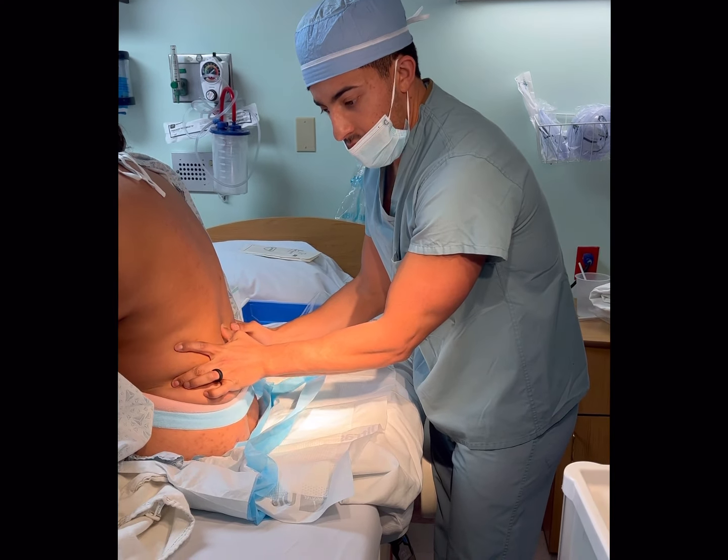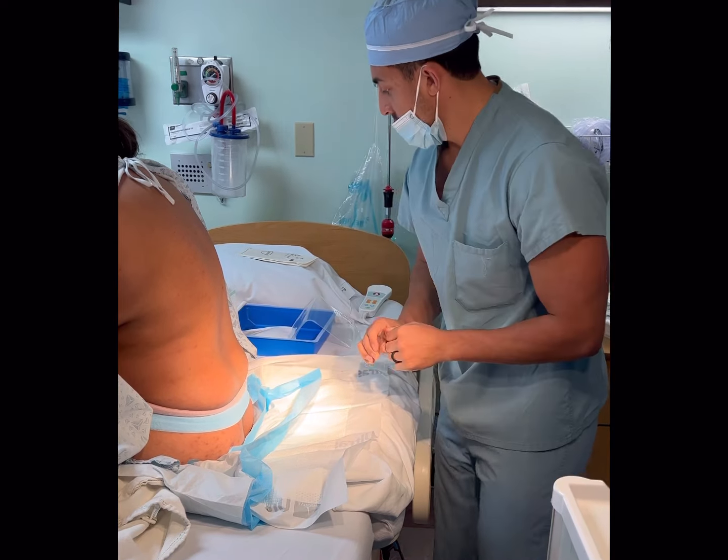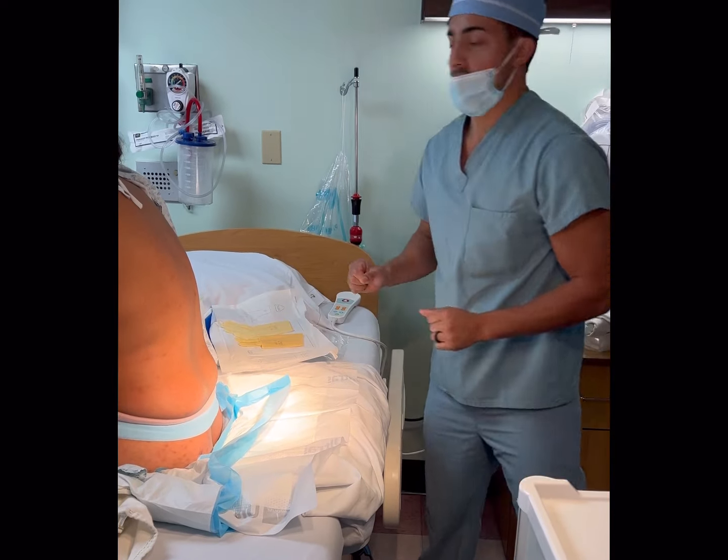This should coincide with L3 to L4, so I'm actually going to use my nail and just put a little indention in there. Okay, I have her set up there. I'm going to get my glove over here. That's why she's starting as a little tachycardic.